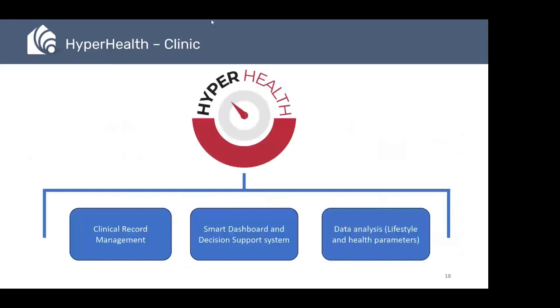Briefly, the platform is divided into clinical record management tools to create and manage the care plan of the patients, and a smart dashboard and decision support system for, first of all, monitoring the patient's adherence to the care plan, and the support system for the management of the arterial hypertension.